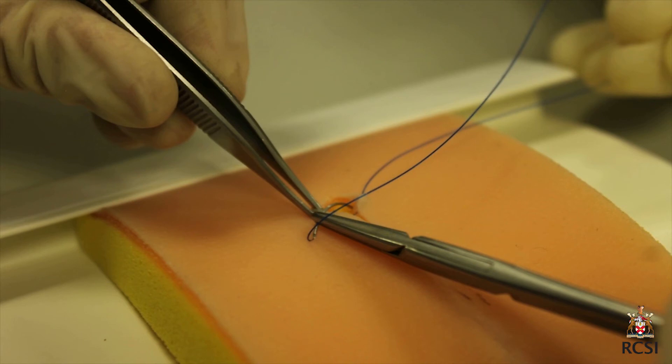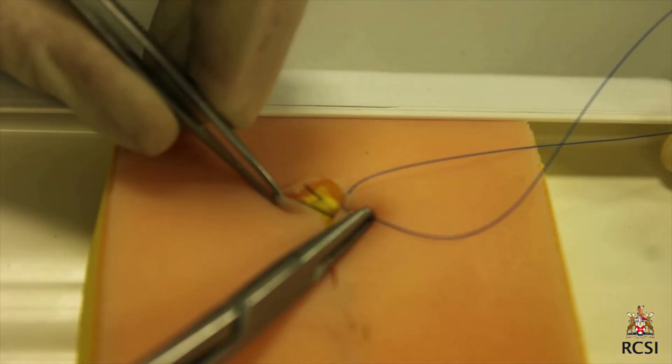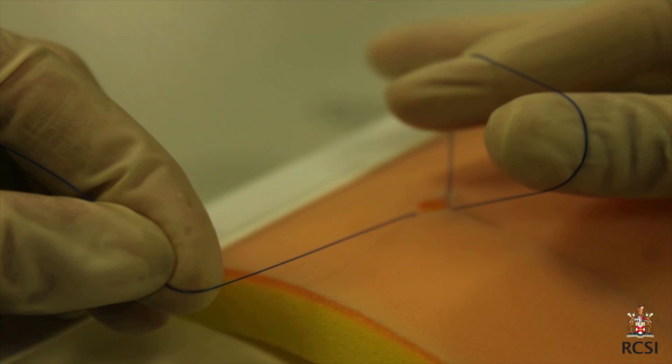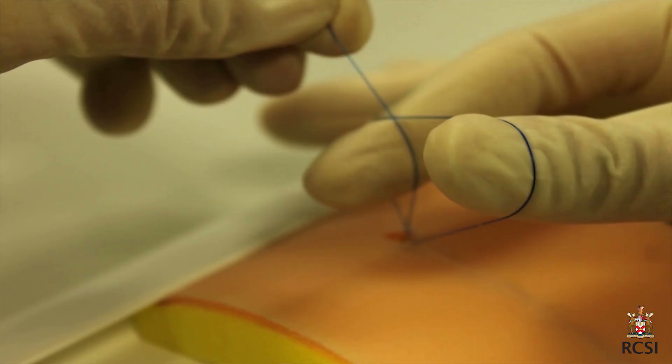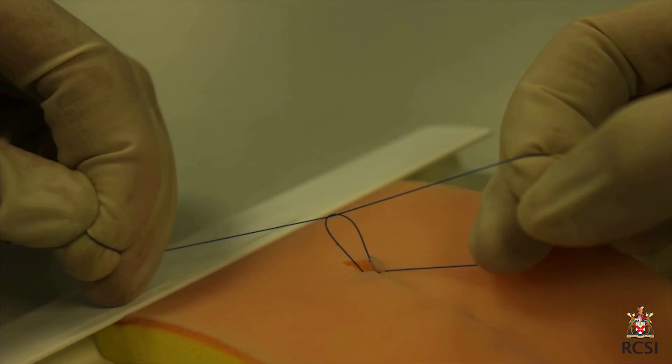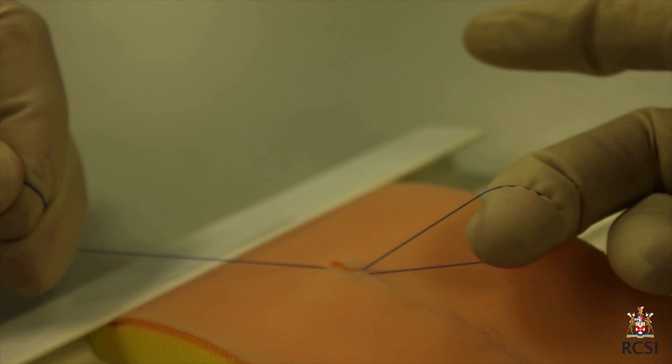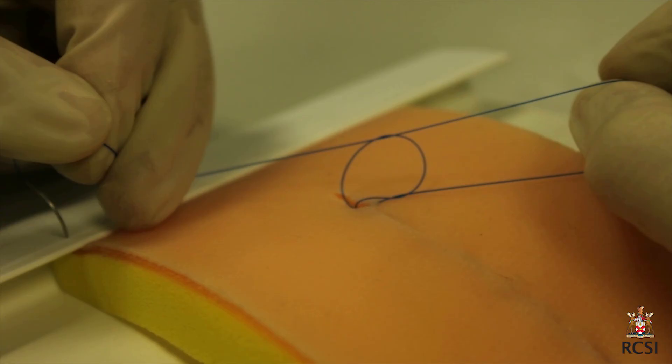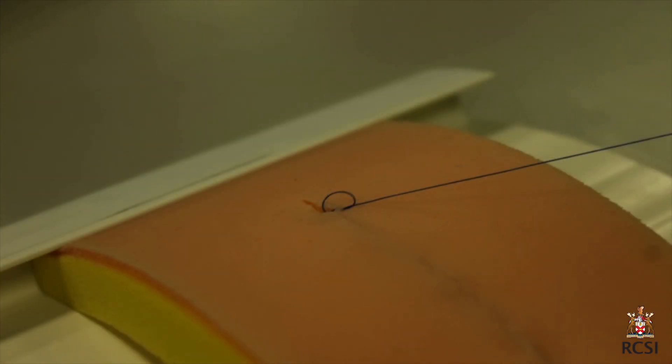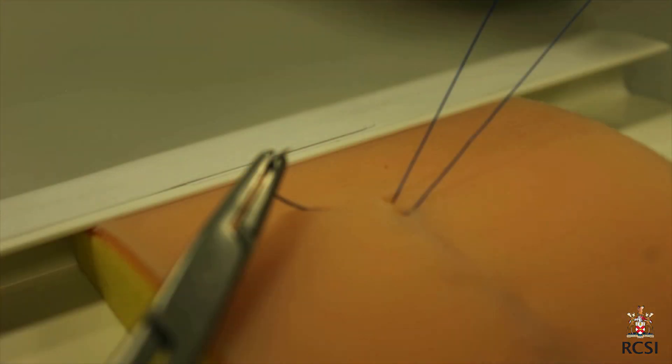The final Aberdeen knot is commenced with a deep bite in the subcutaneous tissue that is not near the dermal edge. It is not pulled fully through to form a loop. The thumb and the index finger that are inserted into the loop grab the long end of the suture. It is pulled through to form a new loop. Note that when tightening the loop, pulling on the lower end of the loop helps in the tightening process. The long end of the suture is pulled entirely through the loop with its attached needle. The knot is buried and the suture is cut.